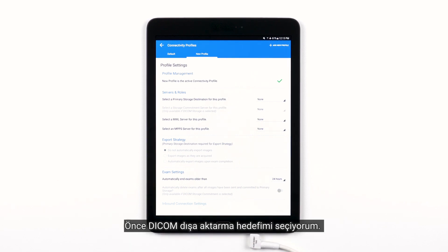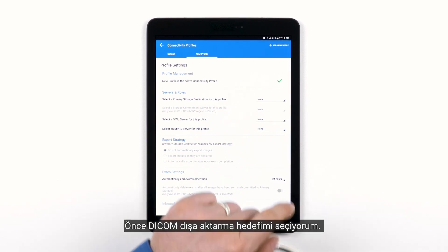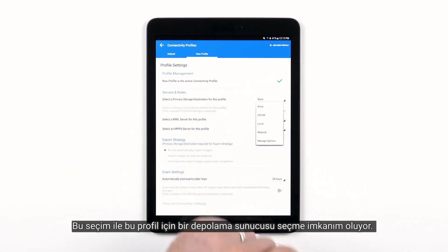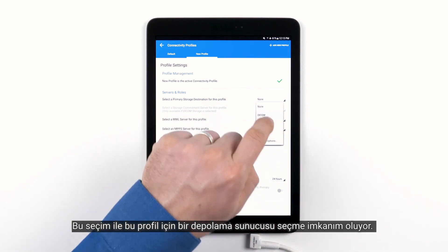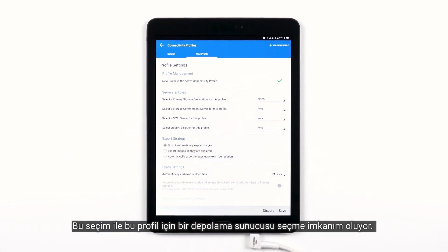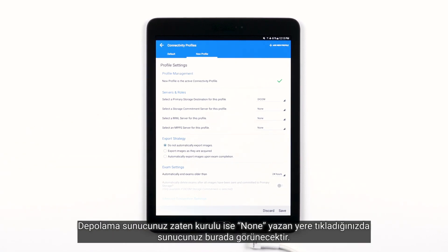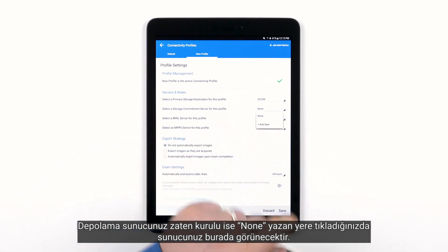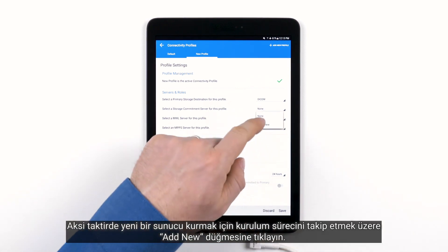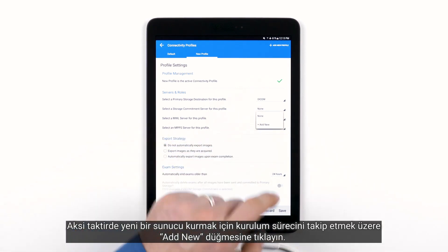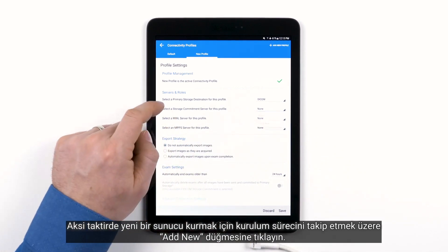First, I choose my DICOM export destination. This gives me the option to select a storage commitment server for this profile. This option will be grayed out for other export destinations. If you have a storage commitment server already set up, your server will show up here. Otherwise, tap Add New to go through the process to set up a new server.